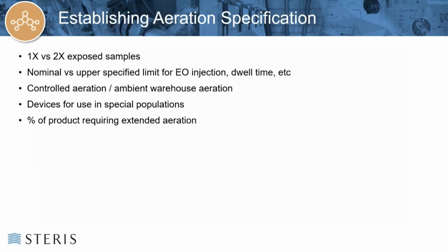Product release requirements can be determined during validation activities without a dissipation curve based on acceptable endpoint testing data, essentially continuing aeration until the product is below the allowable residue limit. Dissipation curve data could be used within calculations provided in ISO 10993-7 to predict when the product would meet the allowable limits if they were not met within the specified test aeration time points. Dissipation curve data would need to be obtained from 3 independent processing runs to establish repeatability.